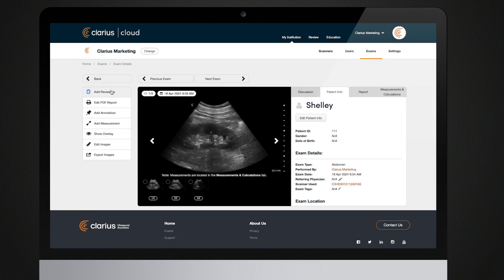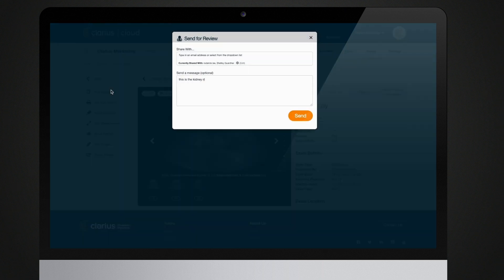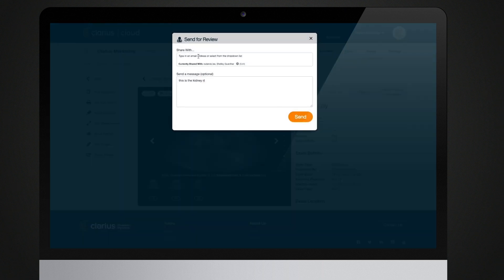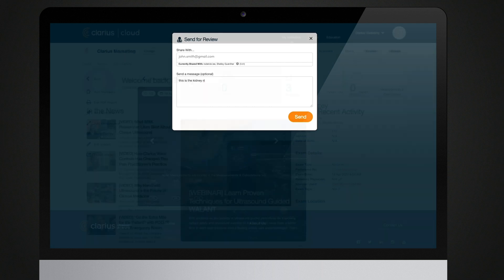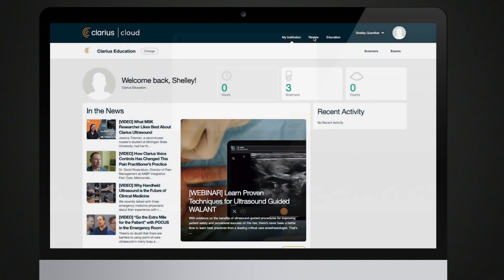You can share exams with people in your institution. You can also share exams with people outside your institution by typing in their email address. They will receive an email with a link to view the exam as a reviewer.